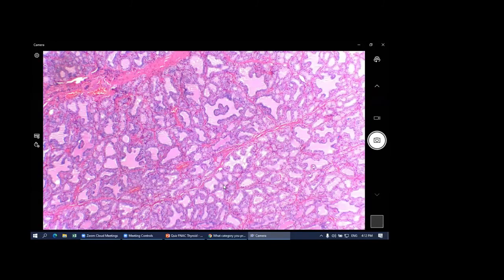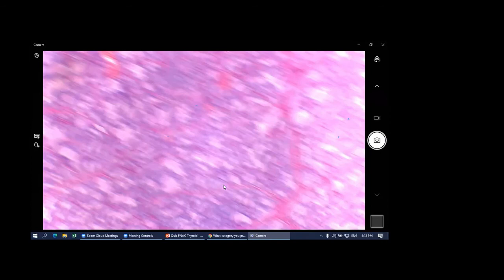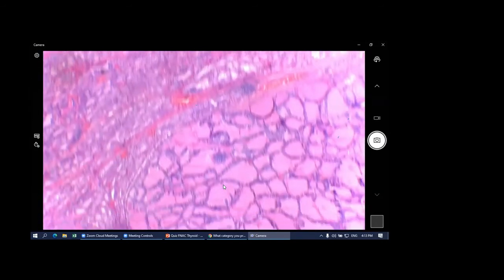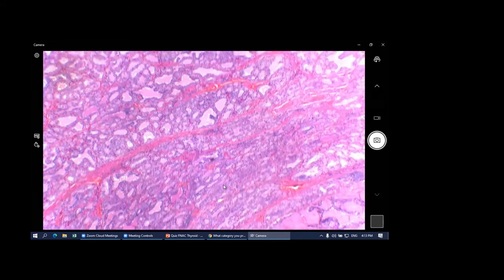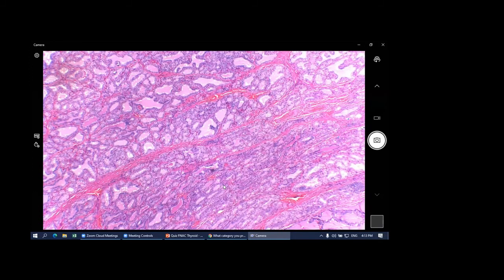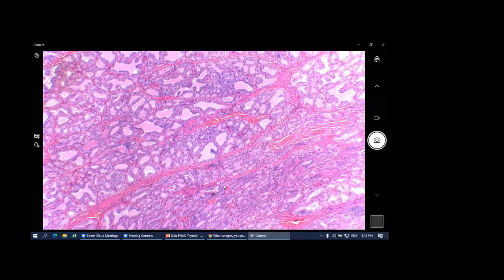So it's not even an adenoma, because it's not even a tumor. It's actually part of the thyroid that became hyperplastic. This is the normal one, okay, and the part up there is the one that became hyperplastic. There is some literature that says when hyperplastic areas become too packed, sometimes they can produce tissue fragments that mimic papillary carcinoma, because you can see there's a lot of these fibrovascular cores as well, right?